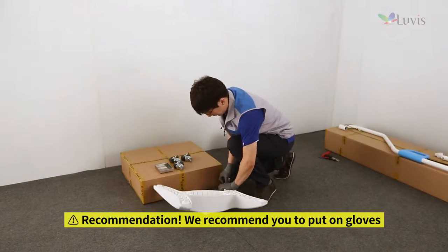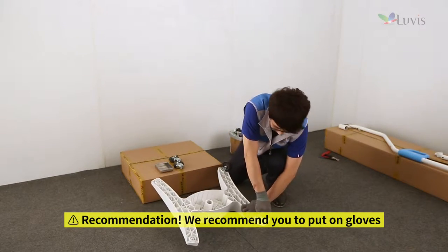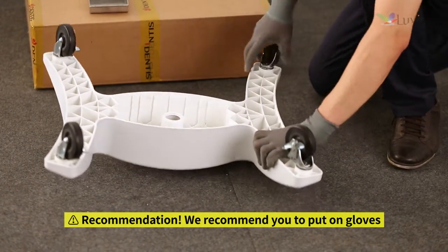Insert four caster wheels into the turned-over base body, regardless of sequence, while pressing with your hand. Hold the base body tightly with your hand so it does not move.